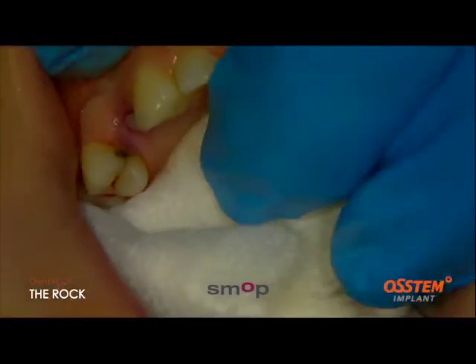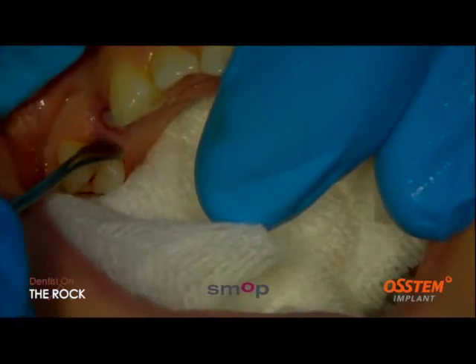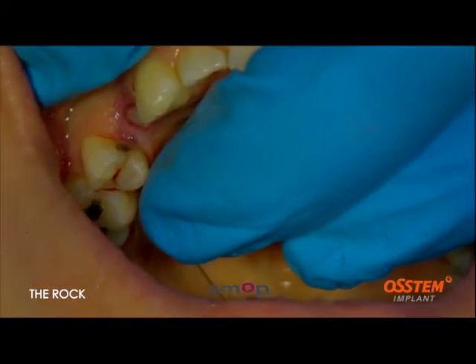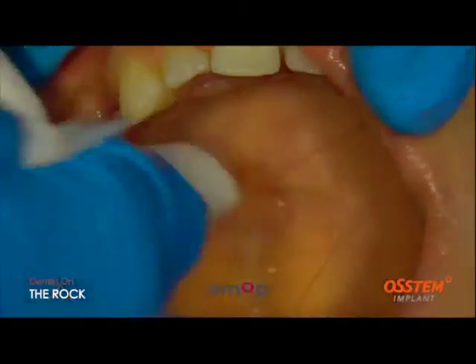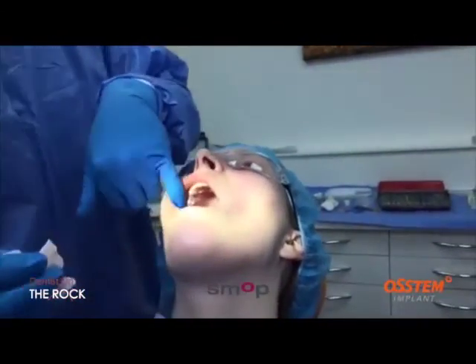Okay. Are you okay there? Mm-hmm. That's now all crispy. That's good. Make sure everything's wet with Corsodyl, if there's anything remaining. And that bit, yeah, you're done. Perfect. Okay. Job done.